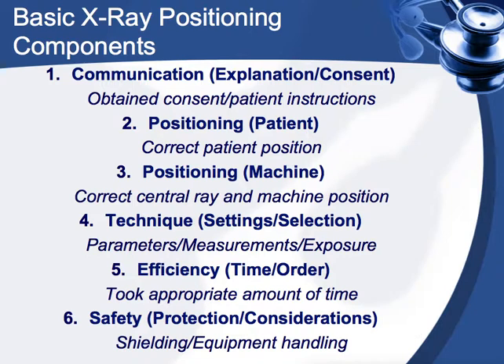Question number 2. You're assessing the patient positioning. Did the intern correctly position the patient? Question number 3. Machine positioning. Did the student position the machine correctly with correct central ray alignment? Question number 4. Technique, settings, and selection. Did the student choose the correct parameters, measurements, and exposure?